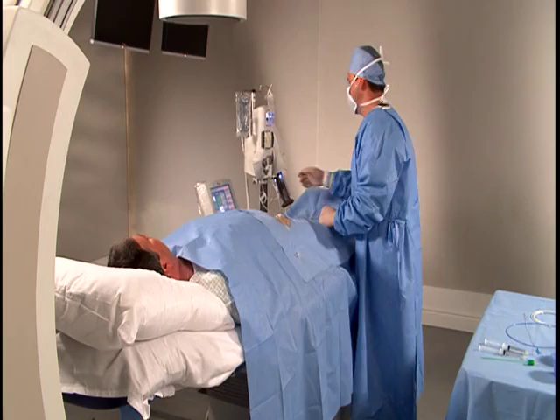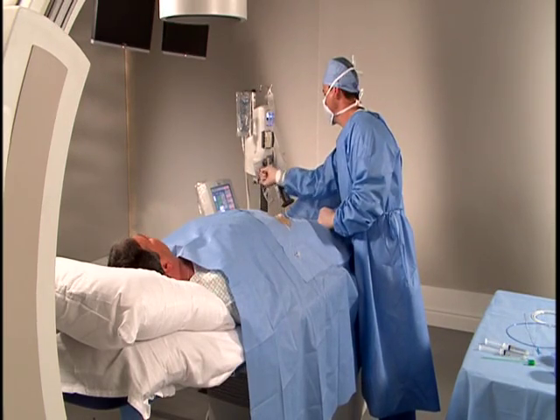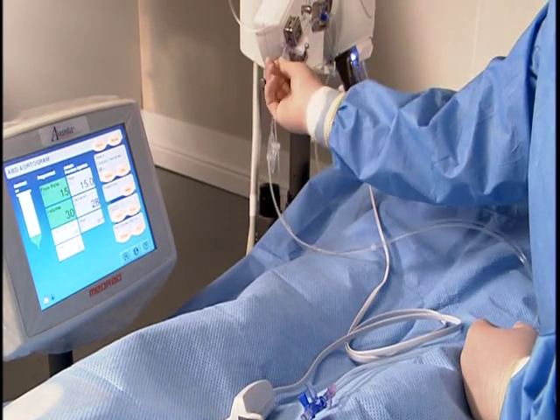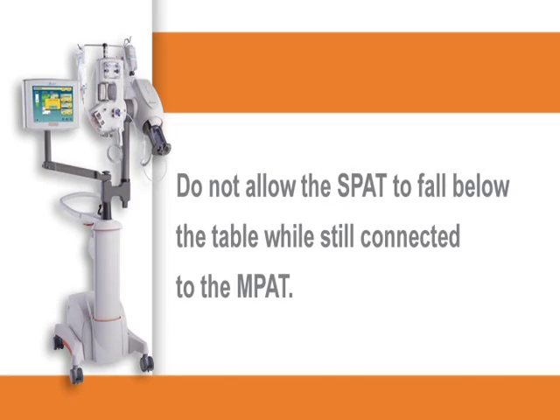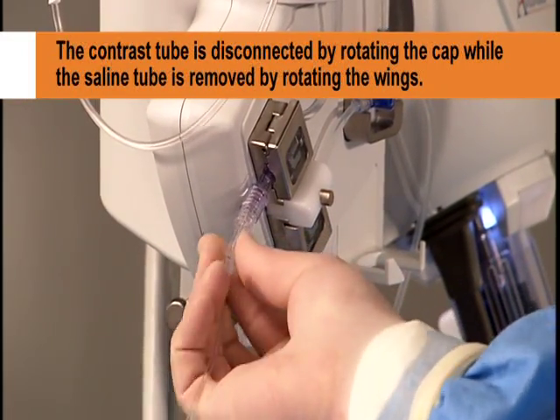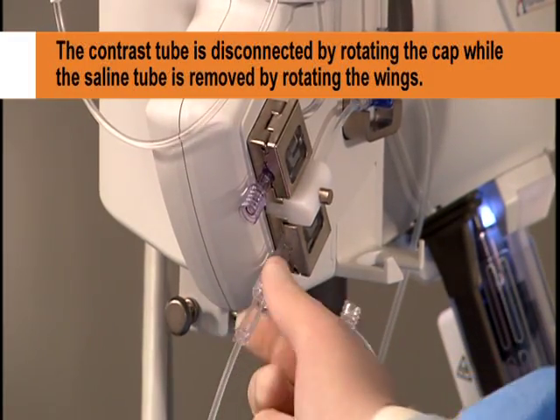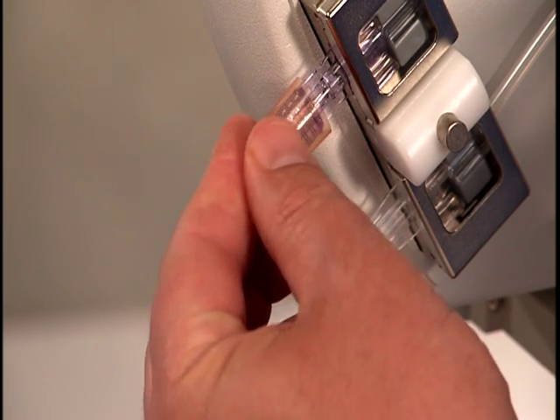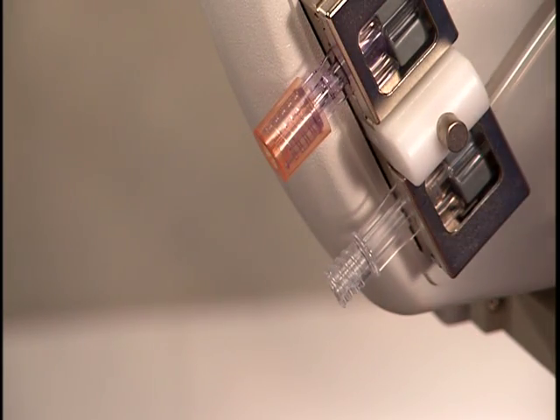After each case, immediately remove the single-patient disposable set from the multi-patient disposable set by disengaging the multi-guard connectors. In order to minimize the chance of cross-contamination, do not allow the SPAT to fall below the table while still connected to the MPAT. To disconnect the saline tube, rotate the wing. To disconnect the contrast tube, rotate the wing and luer nut. Replace the sterile caps on the MPAT multi-guard connectors to maintain sterility for the next case.